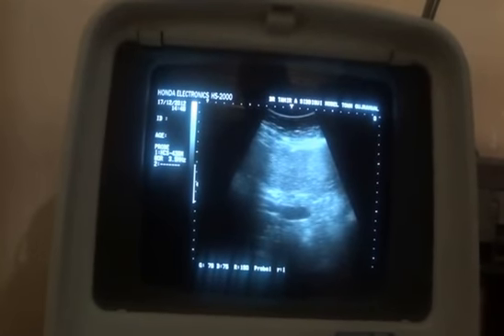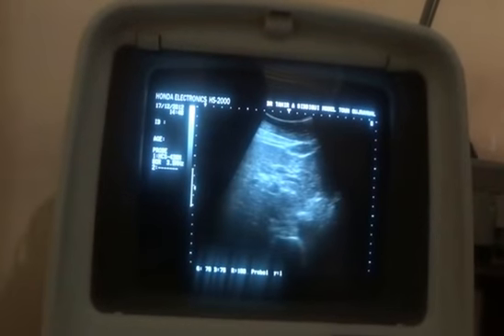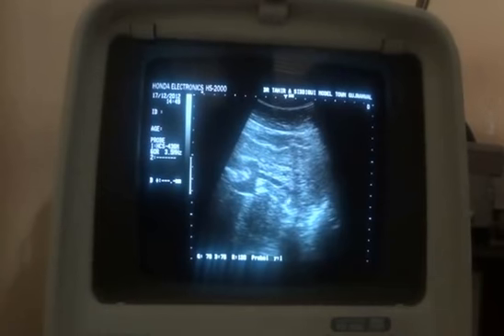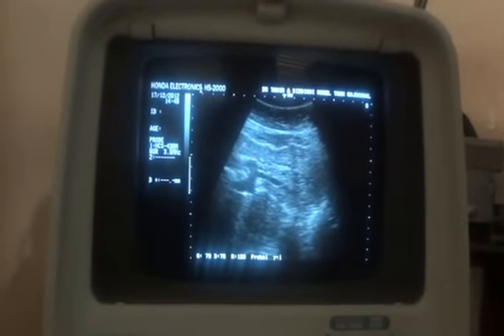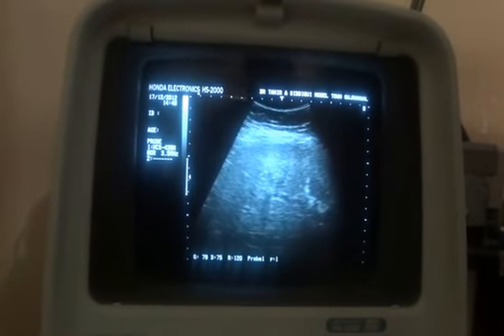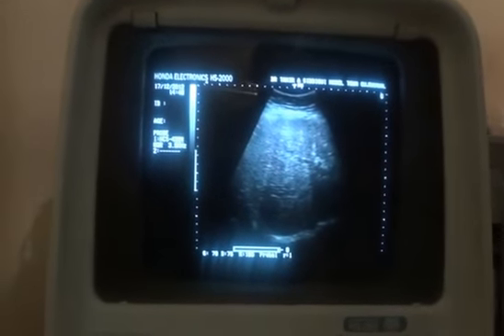This is the portal vein, and here we will see the portal vein branches in the left lobe of the liver in transverse section. This is the left lobe of the liver in transverse section. This is the caudate lobe, ligamentum venosum. This is the ascending portion of the left portal vein, and these vessels that you are seeing are those of the portal vein, irregular outer margin, and coarseness of the liver parenchyma. All these findings are suggestive of cirrhotic liver.